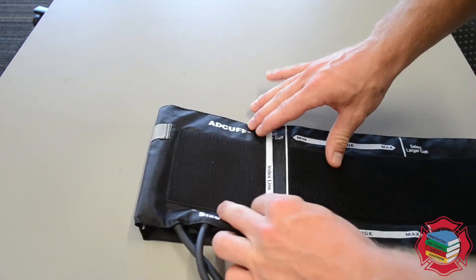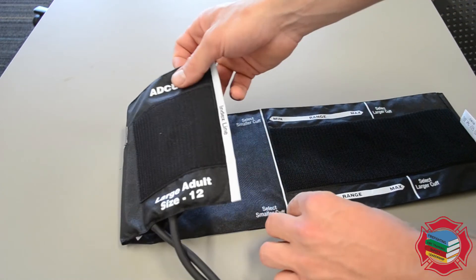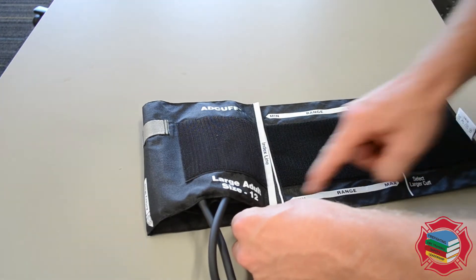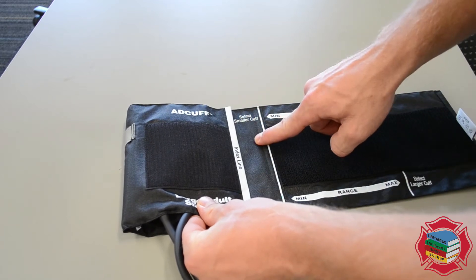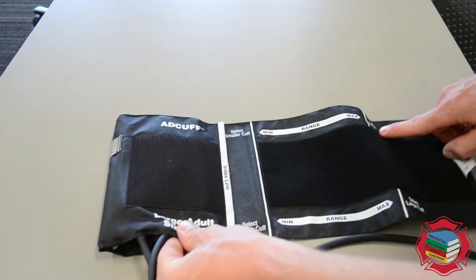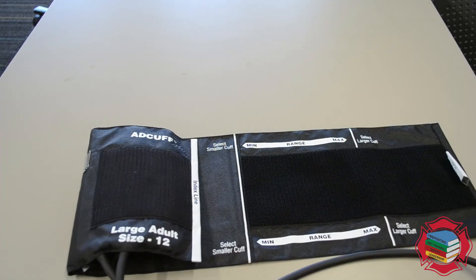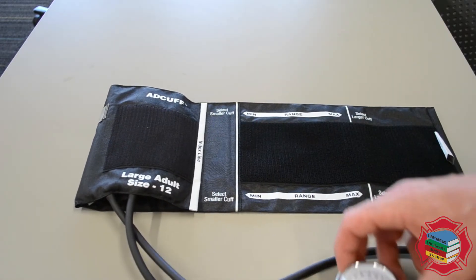A couple things that you need to be familiar with. The index line is found on the far edge of the blood pressure cuff. The index line needs to fall between the minimum and the maximum range in order for this cuff to work correctly. If you fall outside of the minimum you must select a smaller cuff; if you fall outside of the maximum you must select a larger cuff. Sizing of the appropriate blood pressure cuff is essential to getting an accurate readout.